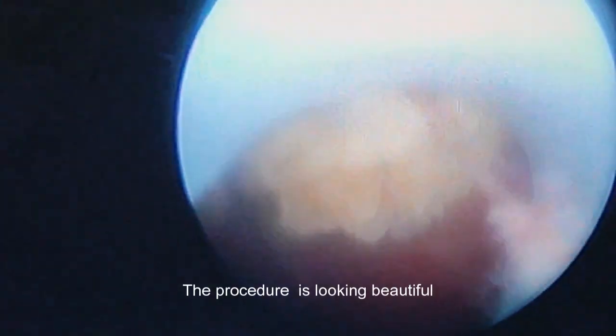Okay. So, like I was saying, adversity is part of endourology. Absolutely. It doesn't go like you want it all the time, but you must keep your head cool and continue to work at it. There are so many learning points. Yeah, so many learning points. Scissors, please. I really thank you for your patience.